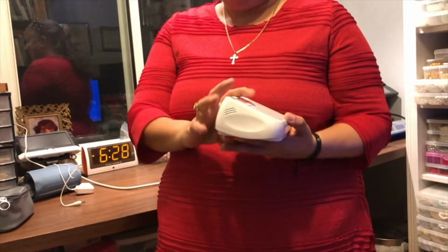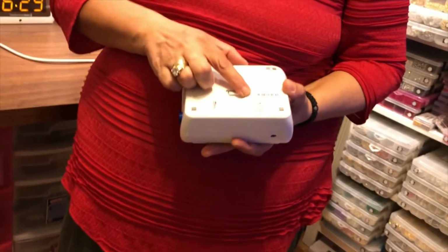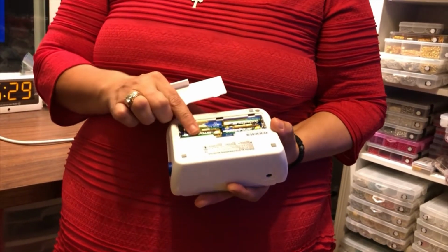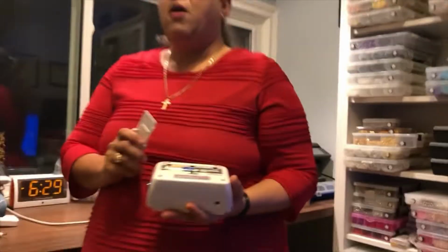If you turn the device upside down, of course, there's a battery compartment. You open it the way you open all battery compartments: there's a little clip that you can feel, and you push it with your finger and open up the compartment, and it has 4 batteries in here. The batteries come with this. They're rechargeable, because let's say you have severe blood pressure issues and you've packed this up in your carrying case and you've gone on a picnic and you're not feeling well. Well, you don't need the power source to take your blood pressure because you have these batteries in here.